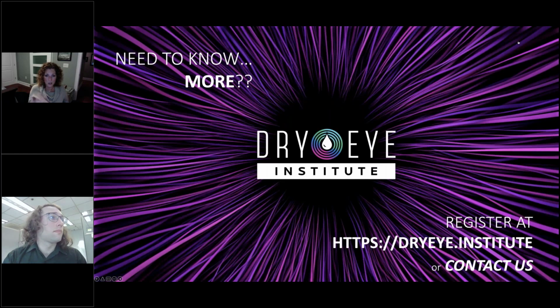As I'm trying to train my technicians to do the acquisition, I'll have her do it on every single patient, just as a good training tool. But when I do my fluorescein video, I always have them blink several times in the beginning naturally. I tell them, it's a white lie, we're just getting ready. You go ahead and blink if you need to, because I don't want them telling me later that, oh, I was trying to keep it open. So on every fluorescein video, we're collecting all that data that I was telling you about earlier. Love it.